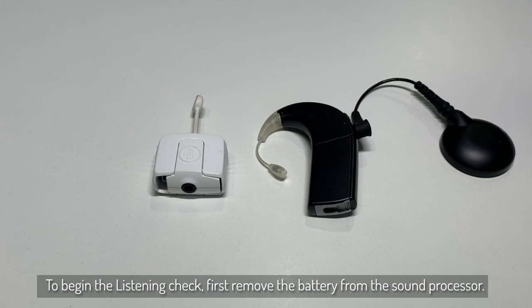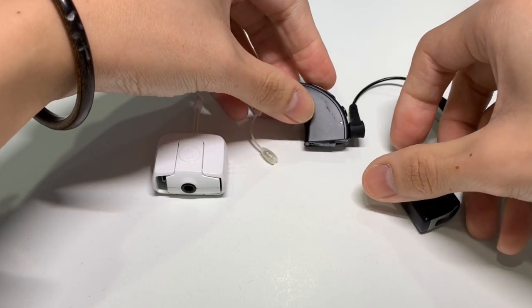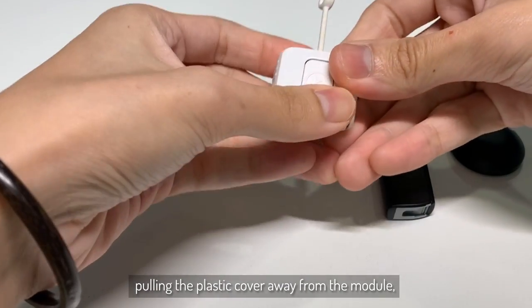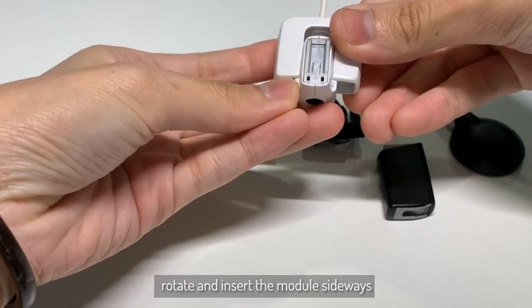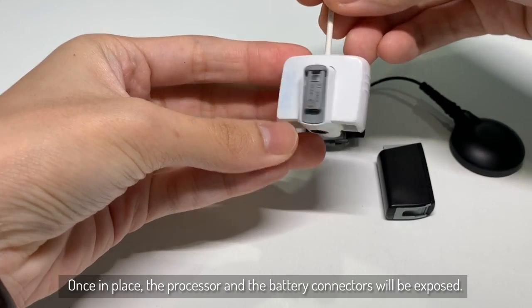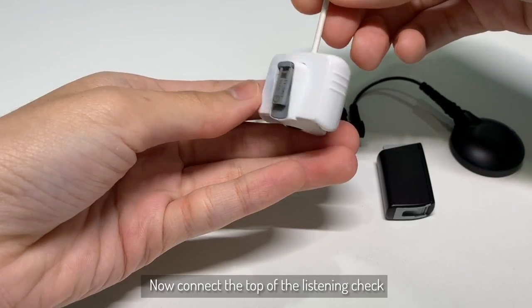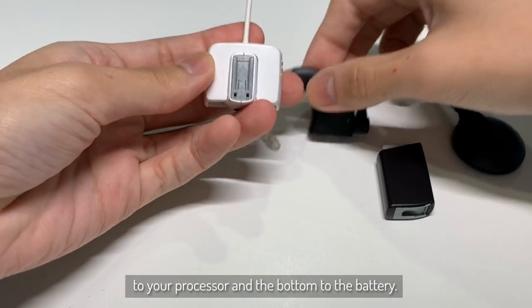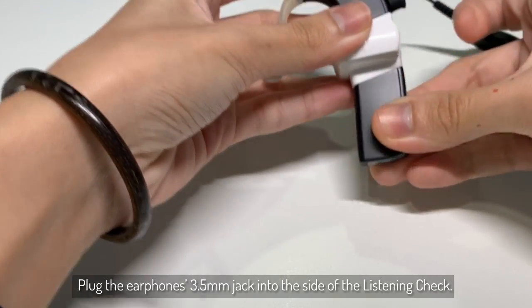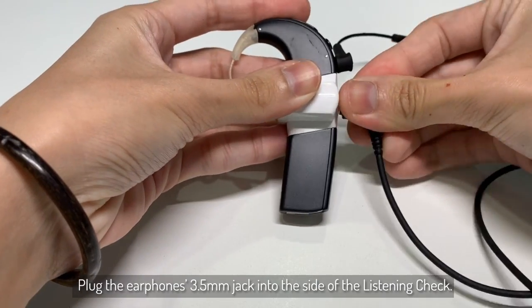To begin the listening check, first remove the battery from the processor. Now open the listening check by pulling the plastic cover away from the module. Rotate and insert the module sideways until you feel the two portions stack into place. Once in place, the processor and the battery connectors will be exposed. Now connect the top of the listening check to your processor and the bottom to your battery. Now plug the earbuds into the 3.5mm auxiliary jack on the side of the listening check.